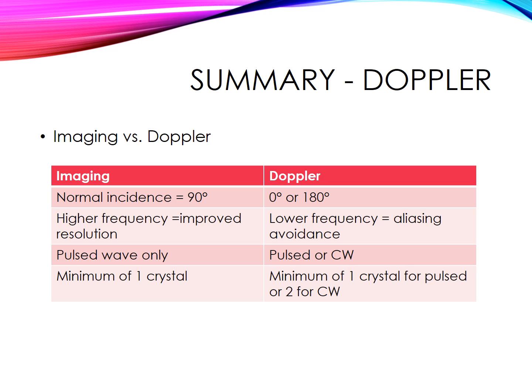And some other tips regarding imaging versus Doppler. There's certain techniques that we want to use when we're trying to get that nice black and white picture versus techniques that we would want to use to get a nice Doppler picture. So when we are imaging items in the black and white mode, we typically want to try to get a 90-degree incidence on it. Whenever we have things that are perpendicular to our sound beam, the sound beam hits everything evenly and it looks really nice.